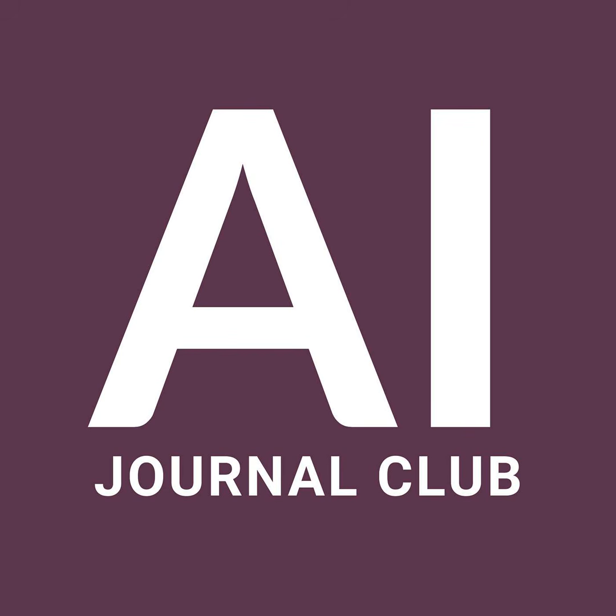Oh, absolutely. Especially when you're dealing with low expression ER or PR, say, trying to decide if less than 10% of cells are showing faint color. Human estimation becomes highly variable. But the AI tools don't have that problem. No, they achieve near-perfect concordance here because they aren't estimating. They are quantifying the exact pixel values of the stain across the entire slide without fatigue or bias.